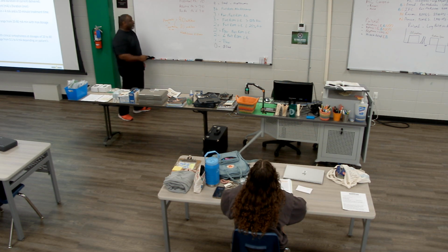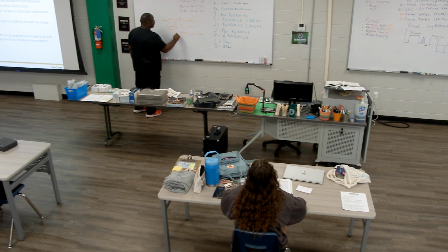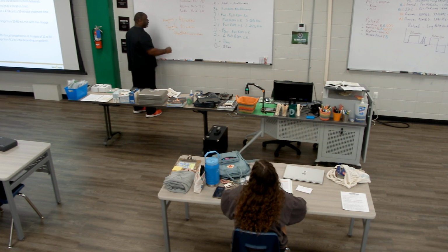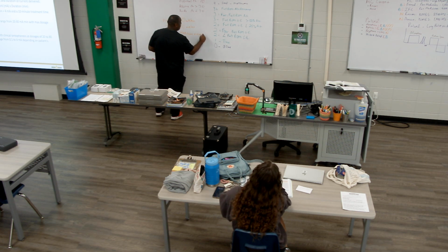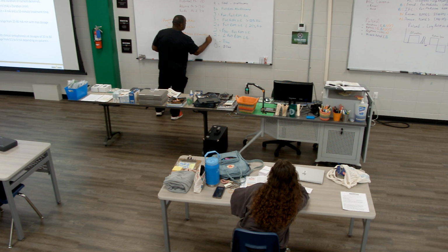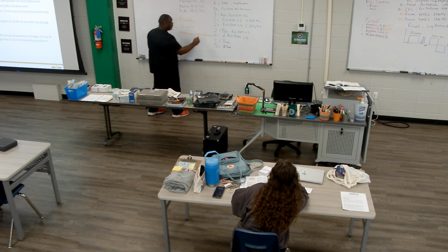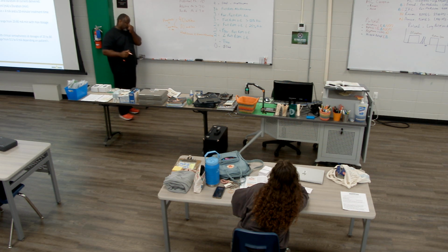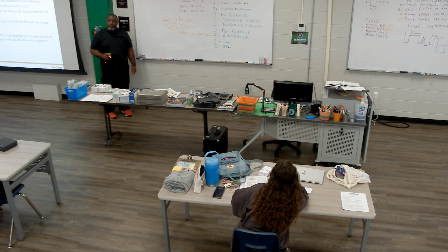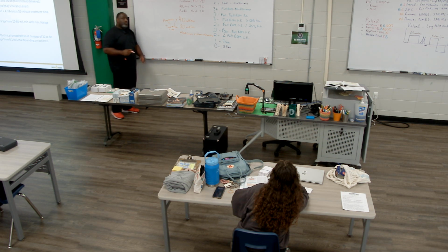That's 4 milliamps of direct current over the area for 10 minutes, a 40 milliamp minute dosage.